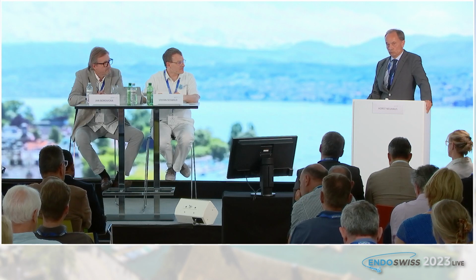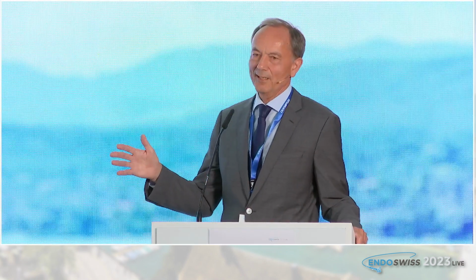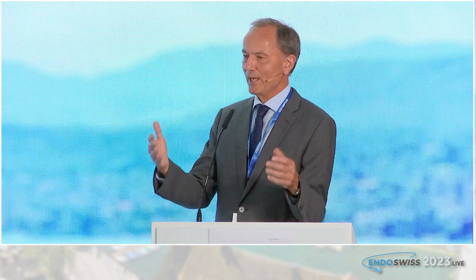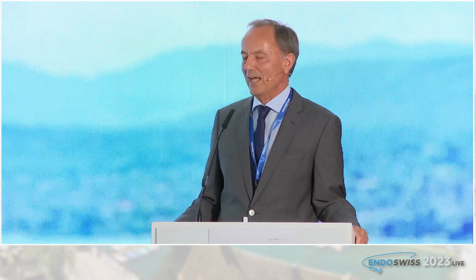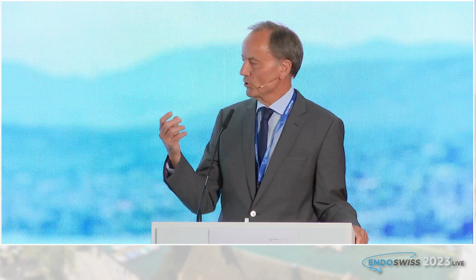But I think we have to be honest, when I saw your videos from the disposable instruments, I think with regard to the white light, they are almost comparable with the others, or is this incorrect? So, the image quality? Yes, image quality from the white light. It's probably enough for most of the cases, no? But hopefully I showed. So as you said, I have commitments for Boston Scientific, for Microtech, as well for Olympus. So I'm not biased. But I didn't say this is the best image. Therefore, I showed the videos, and all of you got your own impressions. But I agree. When we see the progress on smartphones, then we can expect, even with the smallest CMOS chips, further improvements.